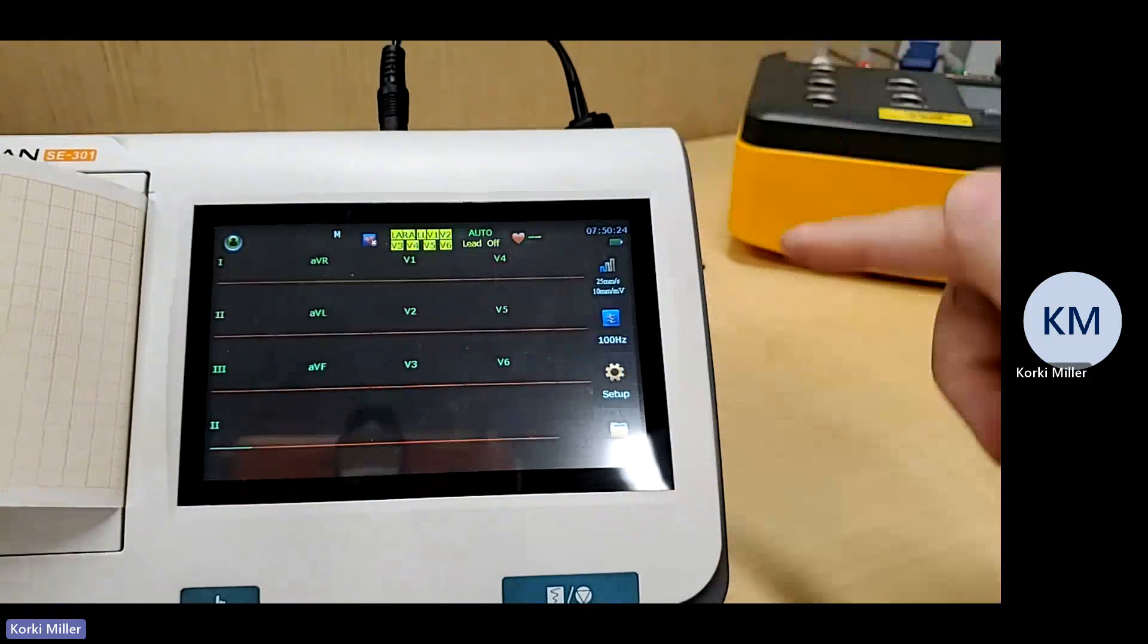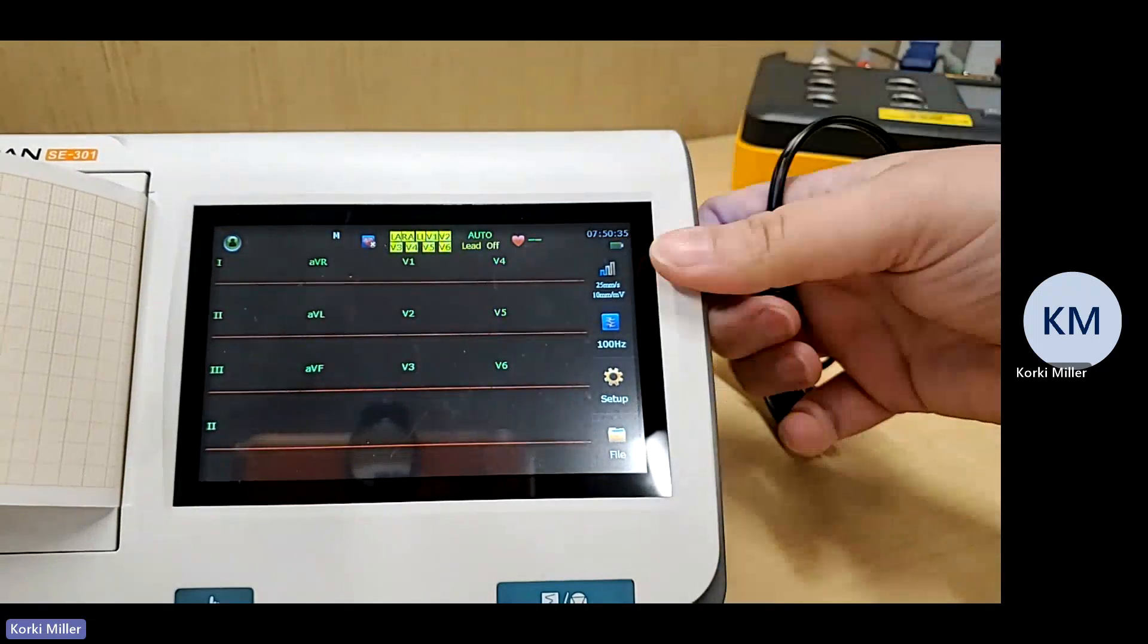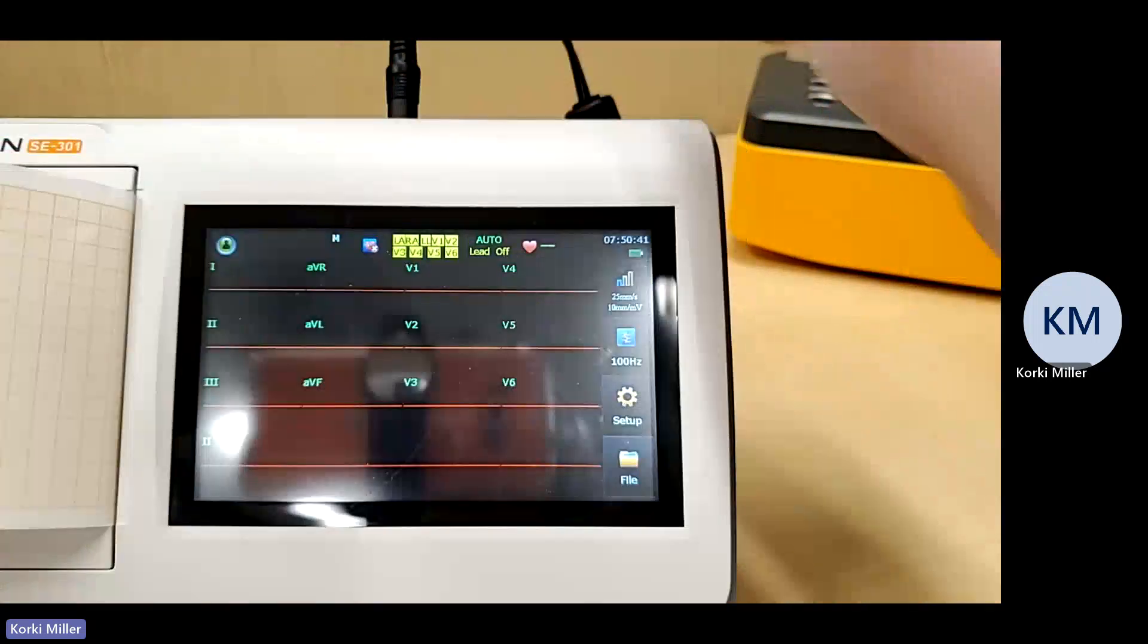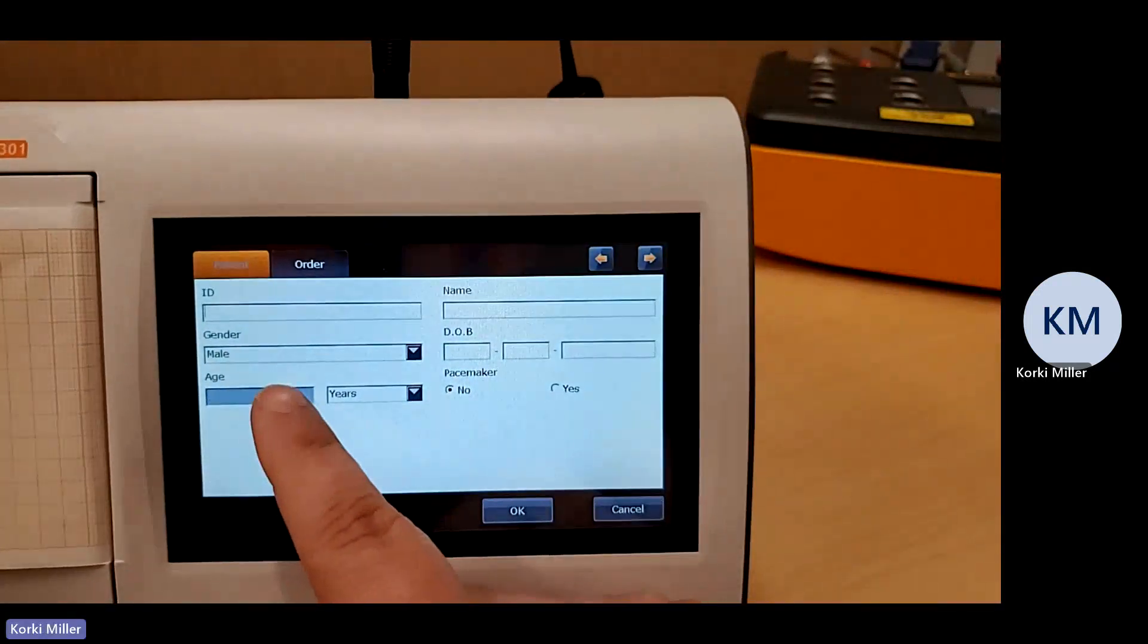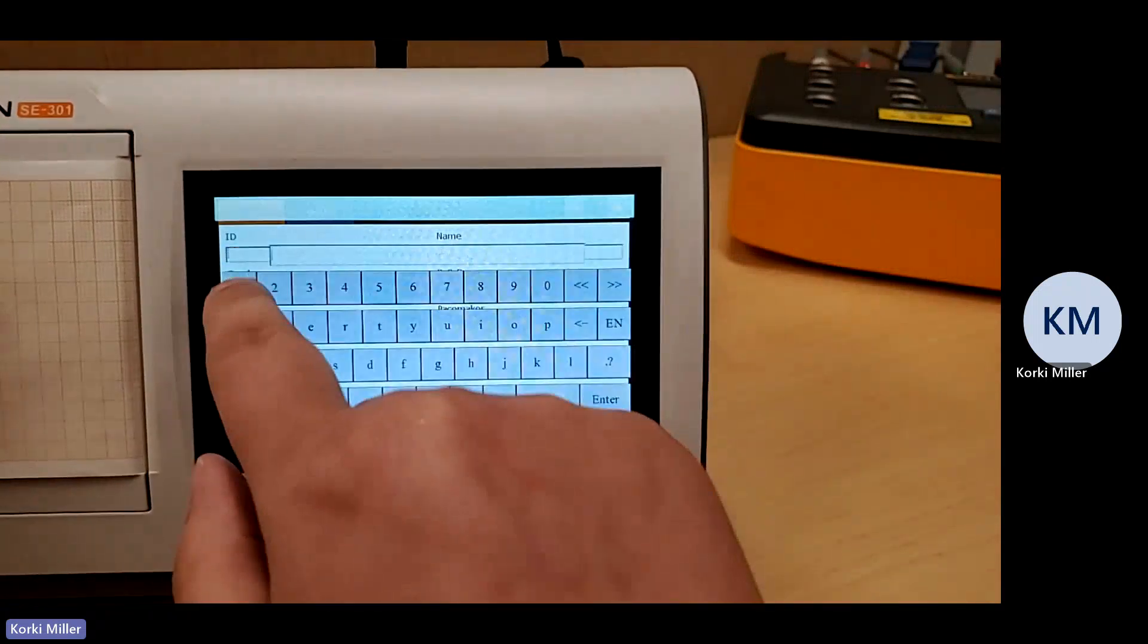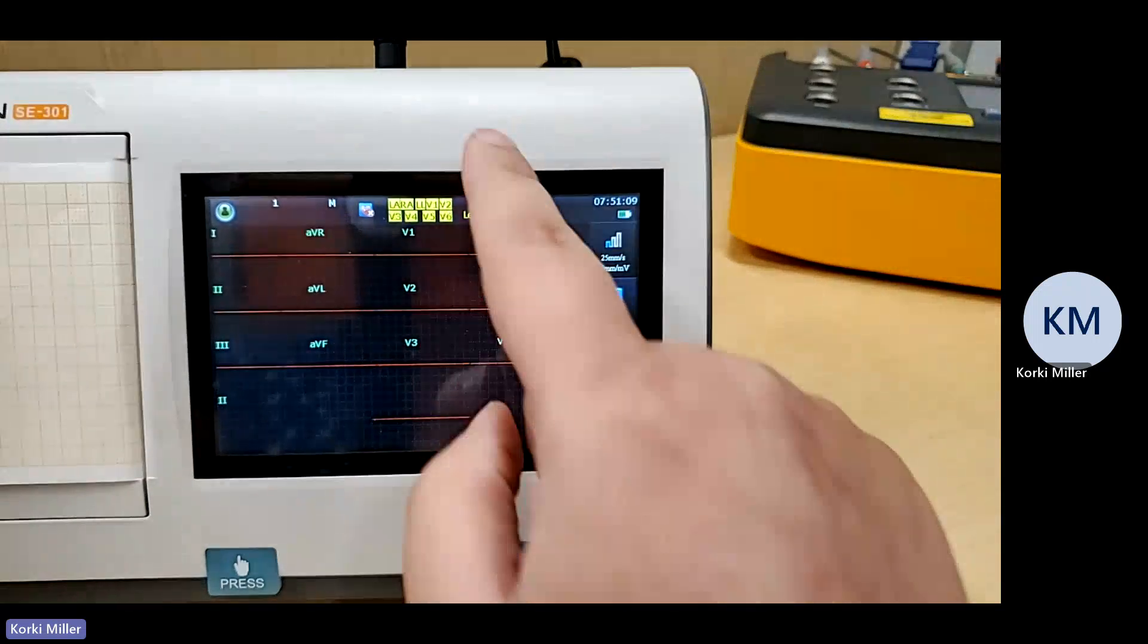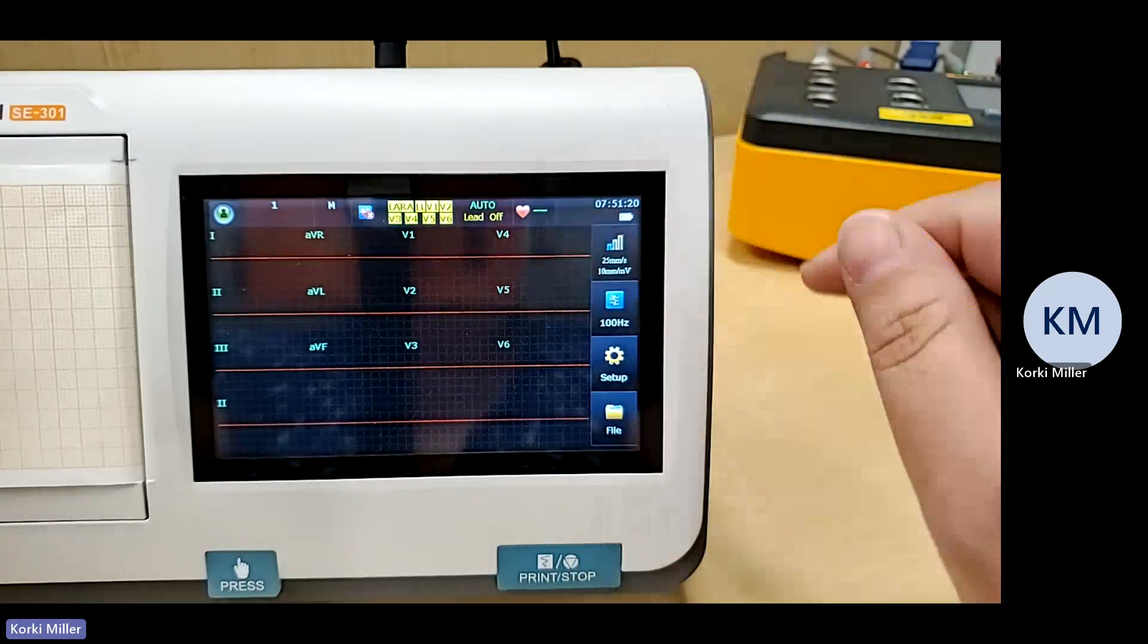Let's go over this. So right now your battery indicator charger is here. So it detects the battery and it is charging. If it wasn't charging and it was just running on battery power, it would show you the battery like this. This little green guy right here is your patient information. ID can be whatever you're using for reference. You enter the name, gender, date of birth. Normally if you're doing anything it might need at least an ID. This is touch screen. So you just have to touch. And enter click OK. So we have our ID there. All our leads here are showing that the leads are off. If they're yellow is letting you know there needs to be attention to them.